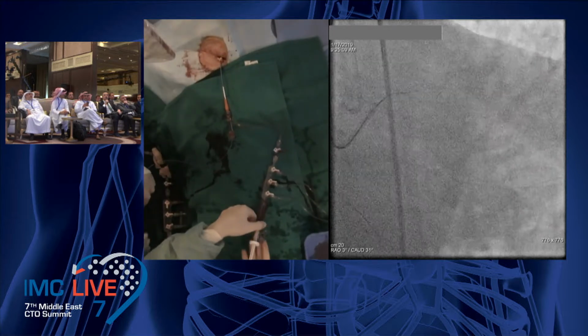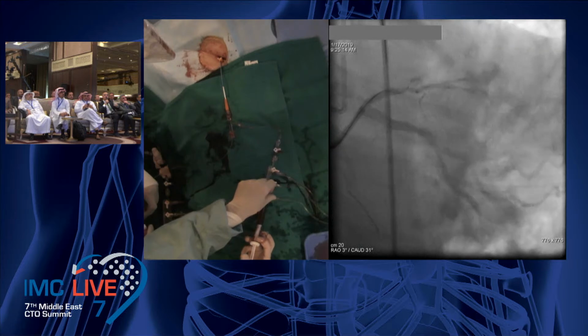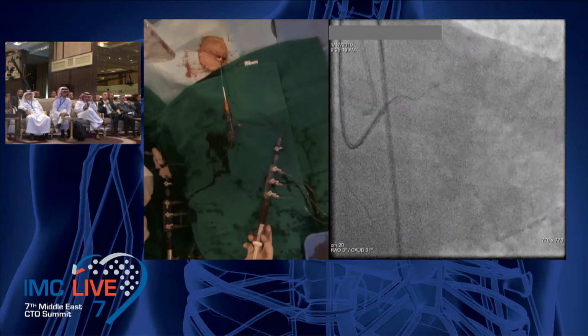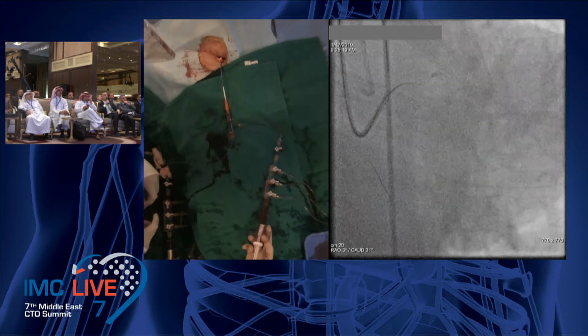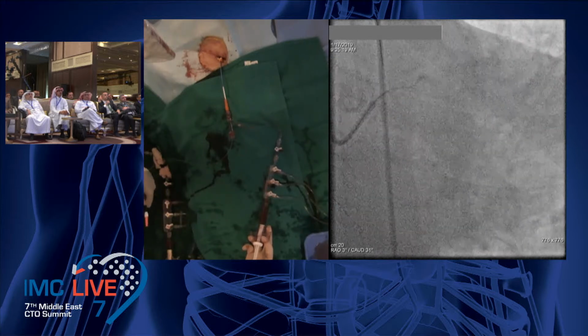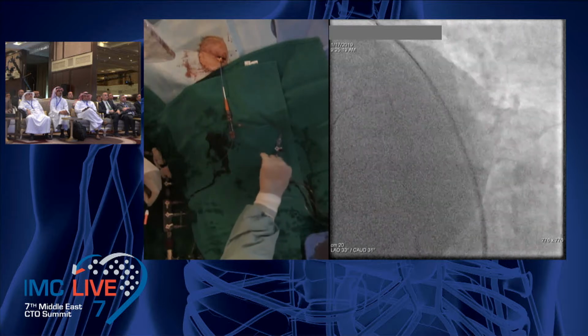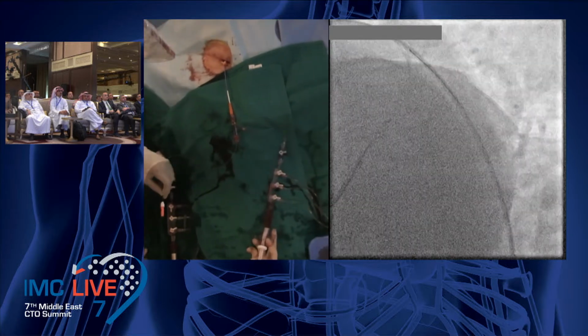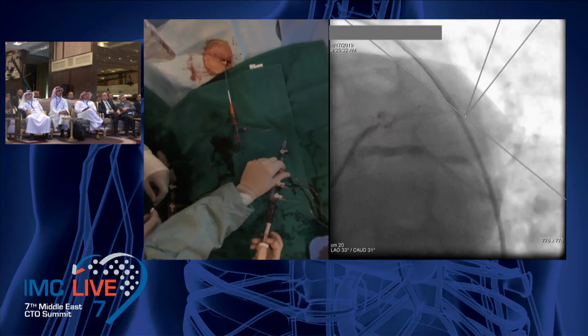Alexander, I would try Conquest 12 as well. It's also a good choice to me in this case. Yes, maybe. For penetration, sometimes we need that wire. Go again. Khalid made us a great demonstration of the feeder. So it's an XTR, Alexander. Yes, I know you like this wire.